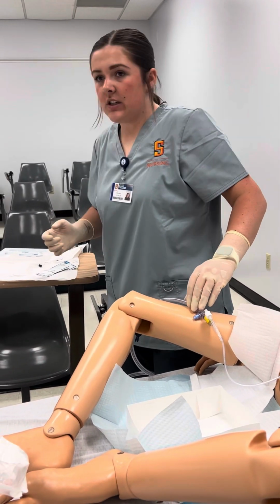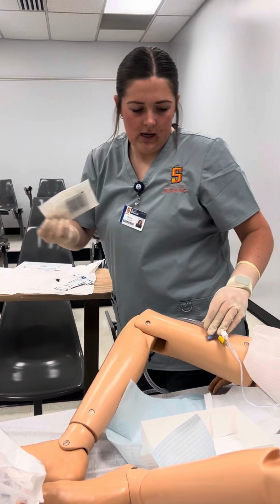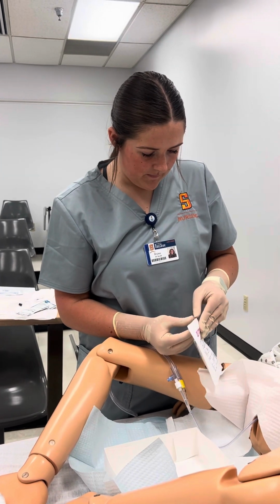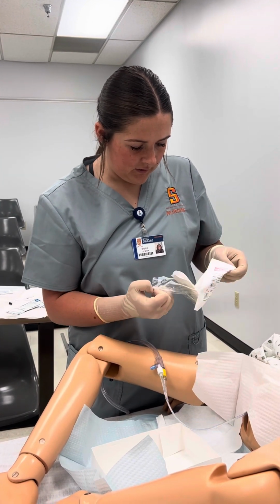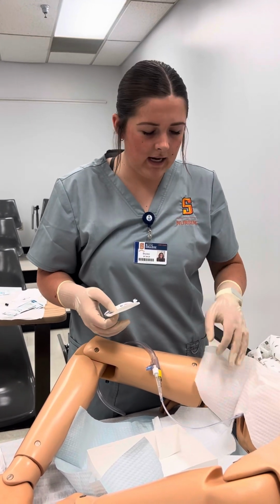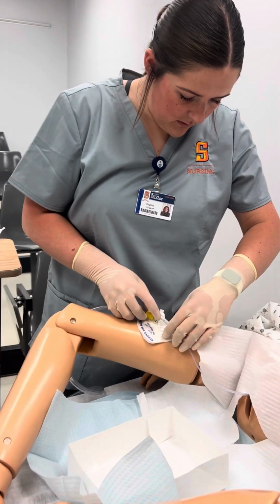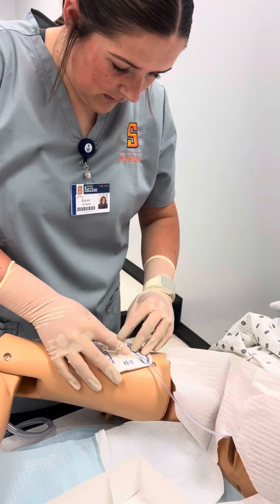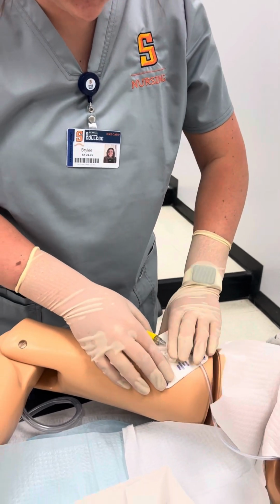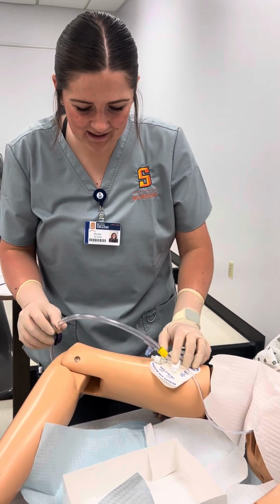But what I am going to do is I am going to grab my cath strap and I am going to attach my catheter to my patient. And I would use some skin prep, but where this is a mannequin, I'm not gonna do that today. And I'm just going to attach it right here at the hub. Just like that, and it would be stuck to the leg with a little bit of slack right there. But where it is on a mannequin, we're not gonna stick it to the leg.